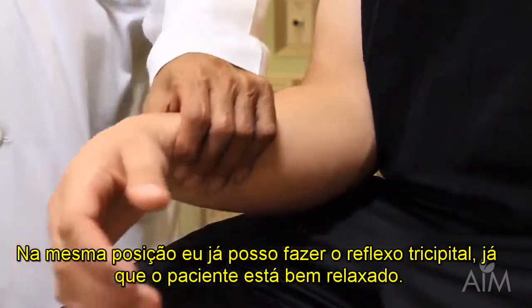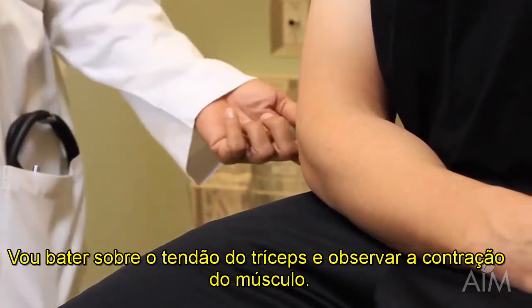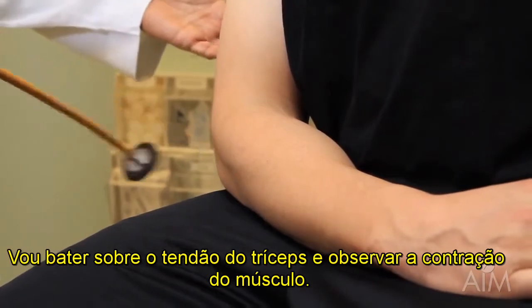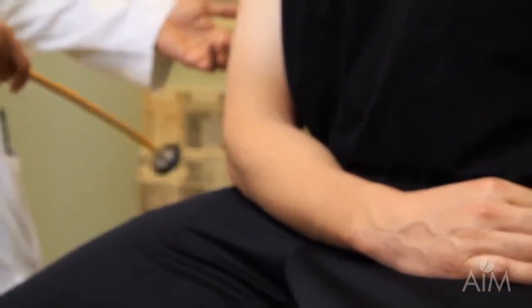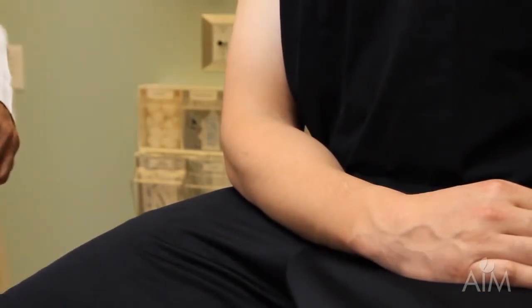In the same position, I can also do the triceps reflex. As the patient is nicely relaxed, I'm going to strike over the triceps tendon and look for the contraction of the triceps muscle. And I see a contraction. You might or might not see a movement of the arm.